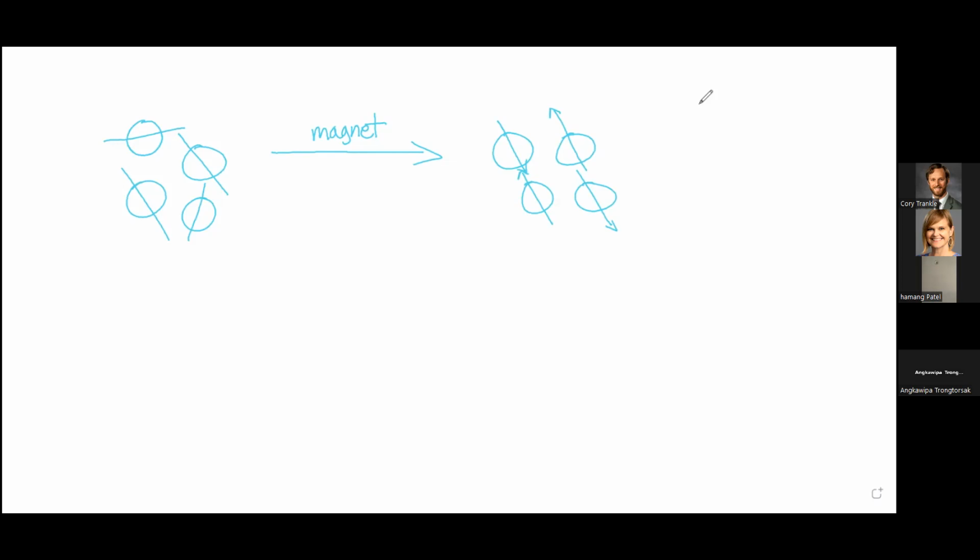No. The next thing that we do is we use non-ionizing electromagnetic radiation. So remember, ionizing electromagnetic radiation, we commonly refer to often as X-rays, right?